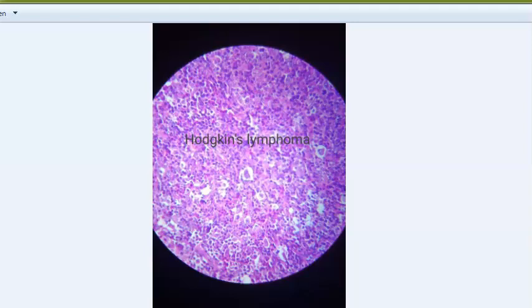Other cells you will see include lymphocytes, eosinophils, histiocytes, granulocytes, plasma cells, neutrophils, and classic Reed-Sternberg cells. The subtypes of Hodgkin's lymphoma include nodular sclerosis, mixed cellularity, lymphocyte rich, and lymphocyte depletion.